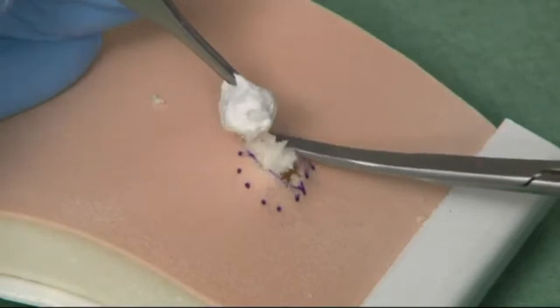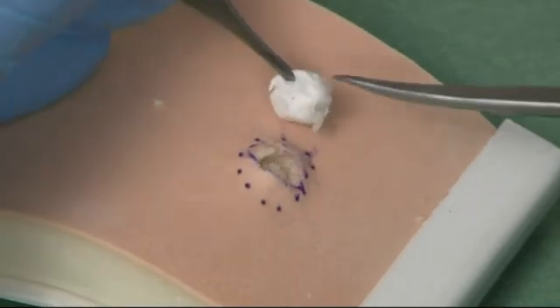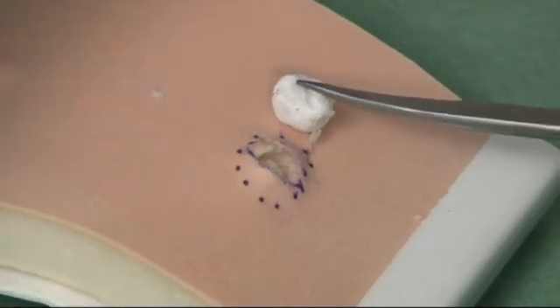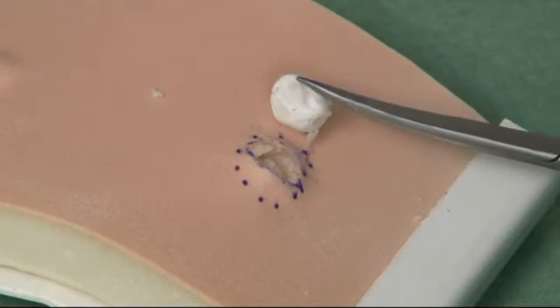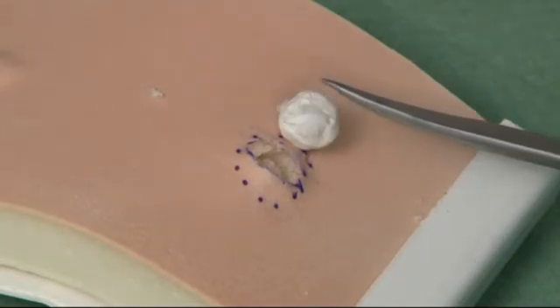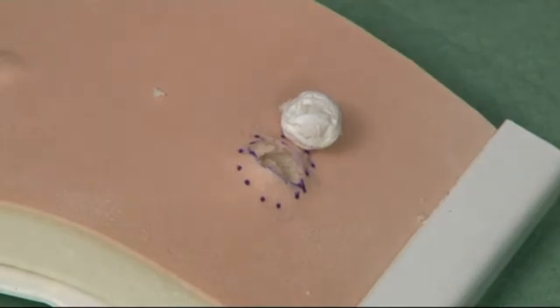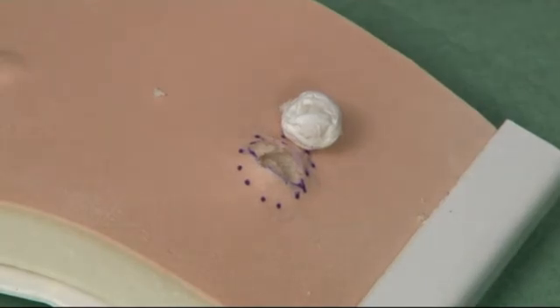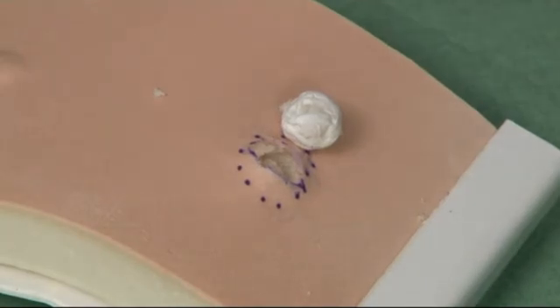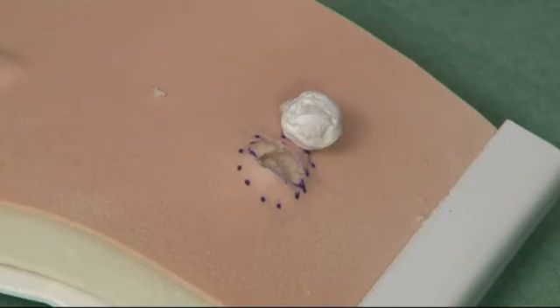When the cyst sac is completely free from the surrounding tissue, it can be lifted out together with the attached ellipse of skin and sent for histology. Be very careful to ensure no fragments of the cyst wall remain behind after closure of the wound. Deep dermal sutures are ideal to close any potential space before closing the skin with interrupted sutures.